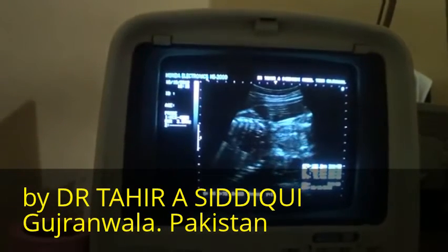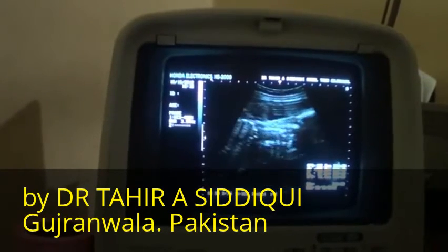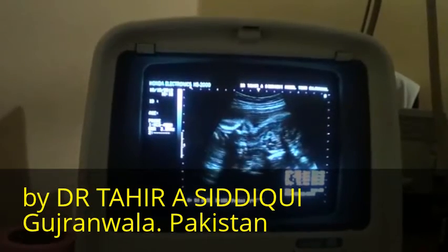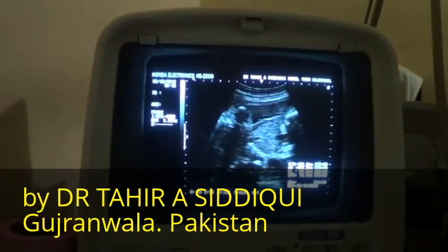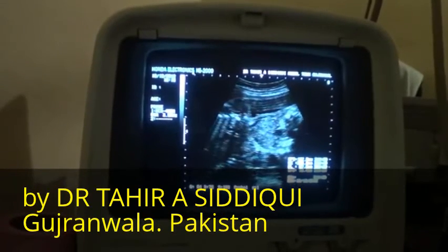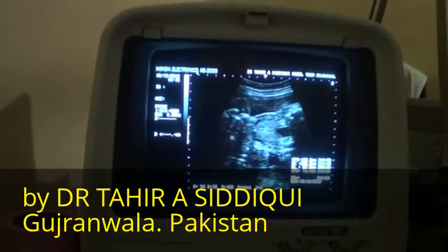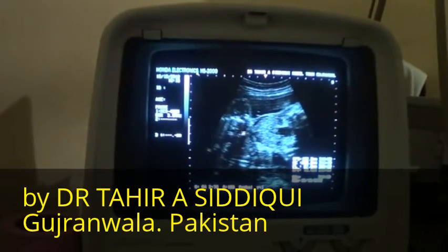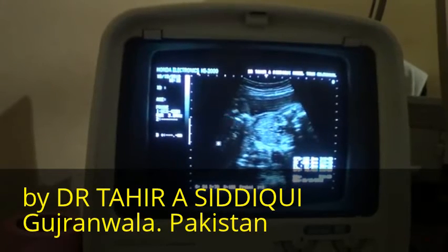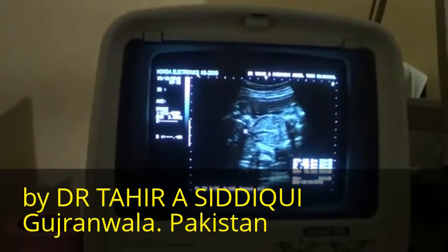Now, I wish to show you the brain, the mass, and the chest together here. Now you see that this is the cardiac activity of the patient. This is the heart of the patient. You can see the cardiac flicker, and even here you can see the cardiac flicker.